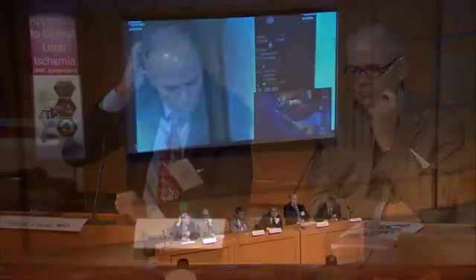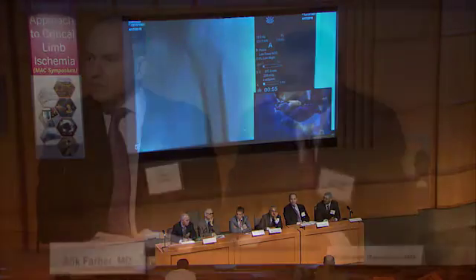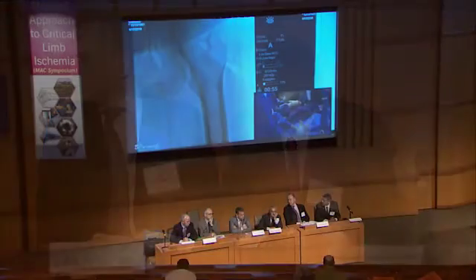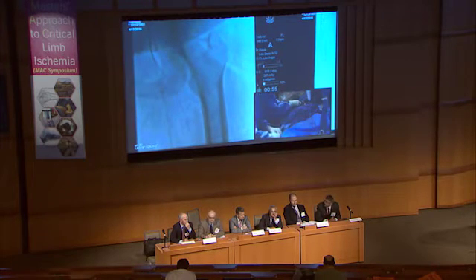I think for me, what Thomas said is very important, which is to know where the location is. And Thomas, can you comment, if you do see multiple points of communication, in this case, would you then cover even the near non-occlusive segments of the SFA and put covered stents all the way through to cover every point of contact? Let's assume it is just in the SFA and not below the knee.